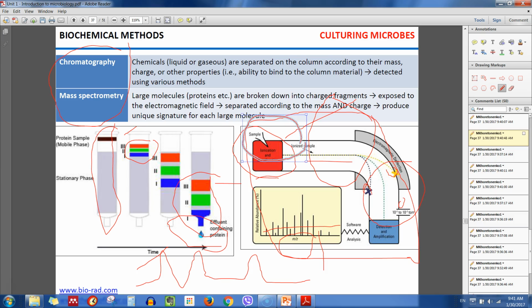But in this case, the only thing you need to have is bacteria in a pure culture. That's the thing. So you can't just take a patient's blood and just stick it in there. There will be too much noise. That makes sense?